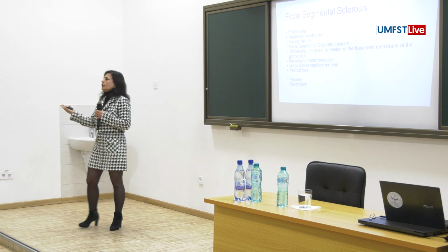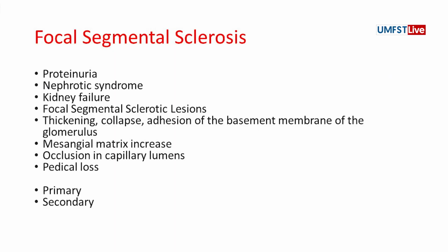If interstitial inflammation and tubular interstitial effect is very apparent, we make a comment: at first we are thinking of a secondary focal segmental glomerulosclerosis.